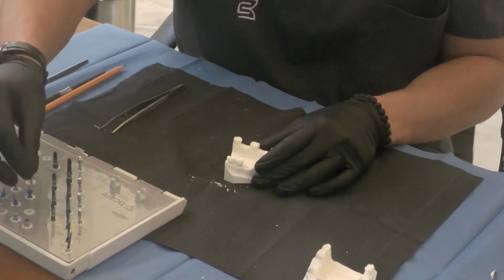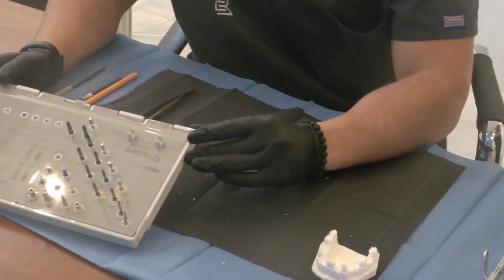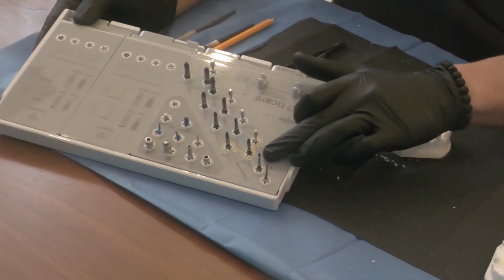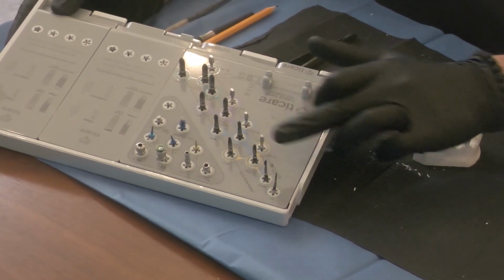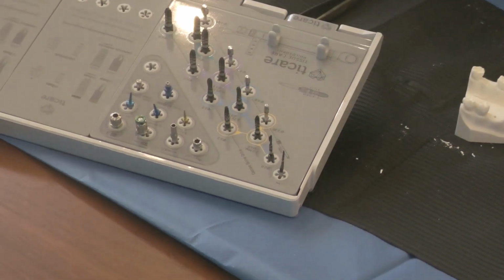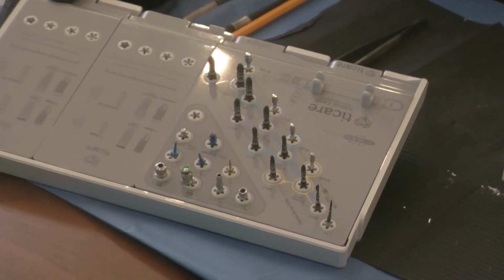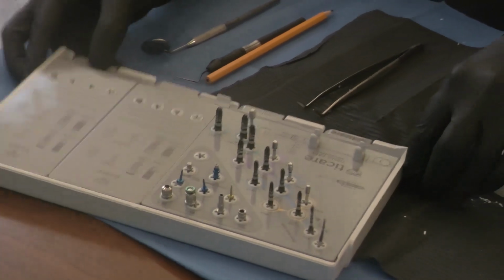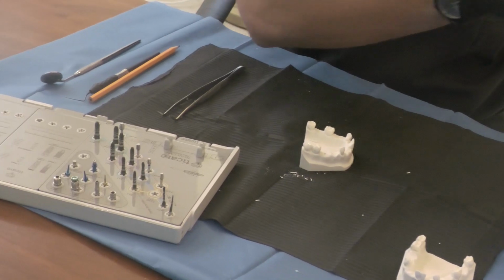Now we follow, and as I have said during the presentation, this cassette is very intuitive since it's color coded, and so it's just a matter of following the sequence. So we have already gone through the 2 millimeter drill, and then we're going to go through the blue path in order to reach the 3.75 millimeter diameter implant, which is going to be the one that will be placed. So we call it the second drill from the cassette.